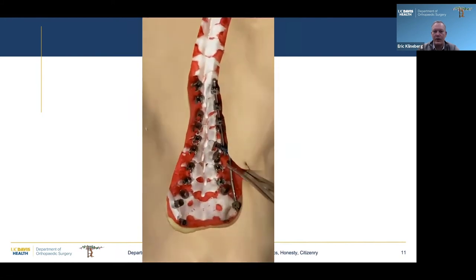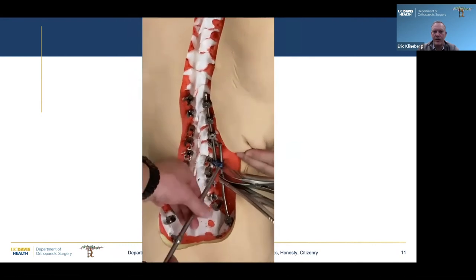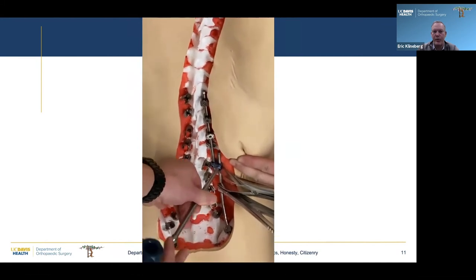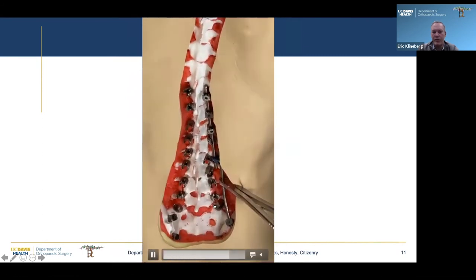And then that rod holder, again, to lift everything out. It's always amazing how much this moves. You can see that whole spine now lengthens, all the foramina open, that concave curve has now been all corrected with just that one pretty simple maneuver.